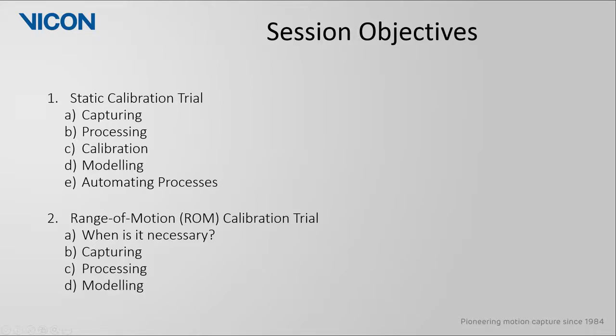For the static trial, we will look at the considerations for capture, processing, and calibrating. We will then look at how to model using this template. Lastly, we will look at how to make this initial step of calibration and modeling more automated.